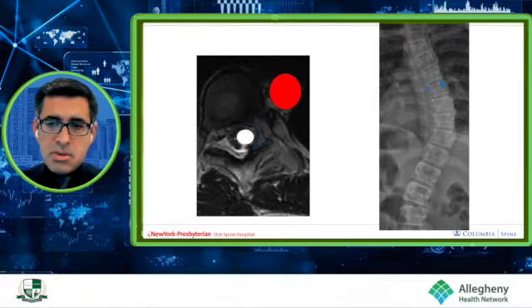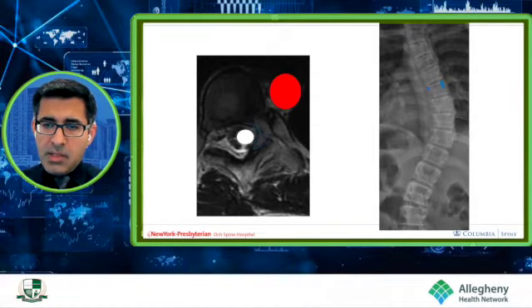And then finally, as you're placing these screws, we need to be aware of where the major vessels are. So these are all the things, and a lot more, that we look at on each specific patient's anatomy to really get an intimate understanding of the specific patient's anatomy, and not just knowing in general terms where the starting points and pedicle screws go, because especially for deformity cases, people have a lot of variation.